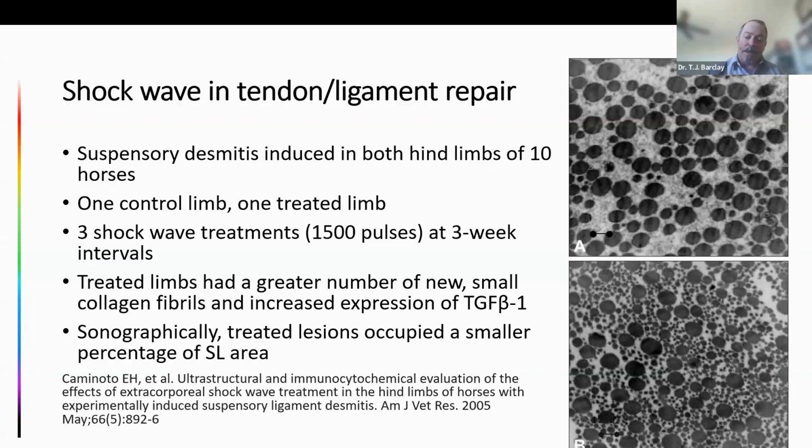So this demonstrates that Shockwave not only speeds the healing of these types of injuries, but it also improves the quality of the healing. We know that tendons and ligaments, when left to their own devices, tend to heal with a lot of scar tissue. That scar tissue is less elastic and therefore more prone to re-injury when those are healed. But if we treat those with Shockwave, rather than depositing scar tissue, we're going to grow new collagen fibers that are going to be more functional and less prone to re-injury.